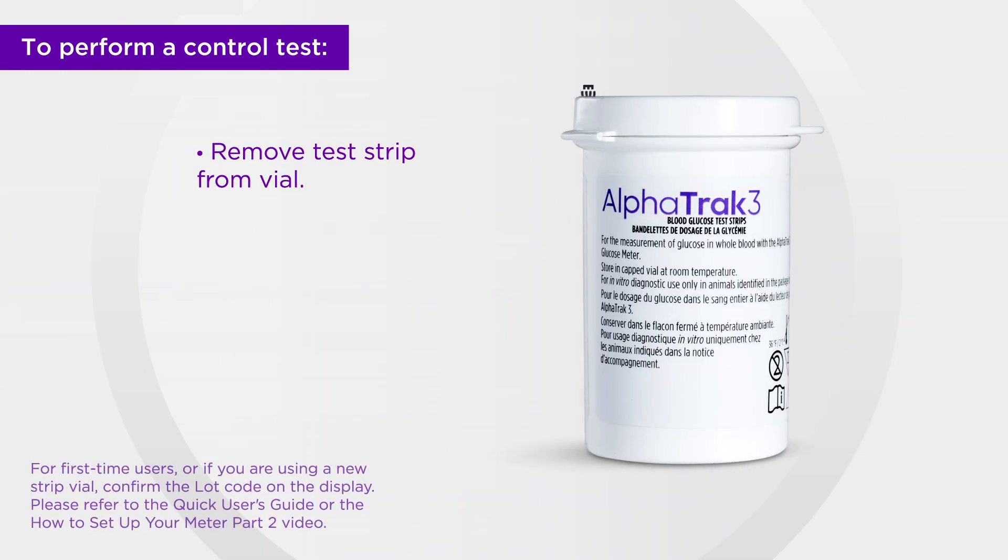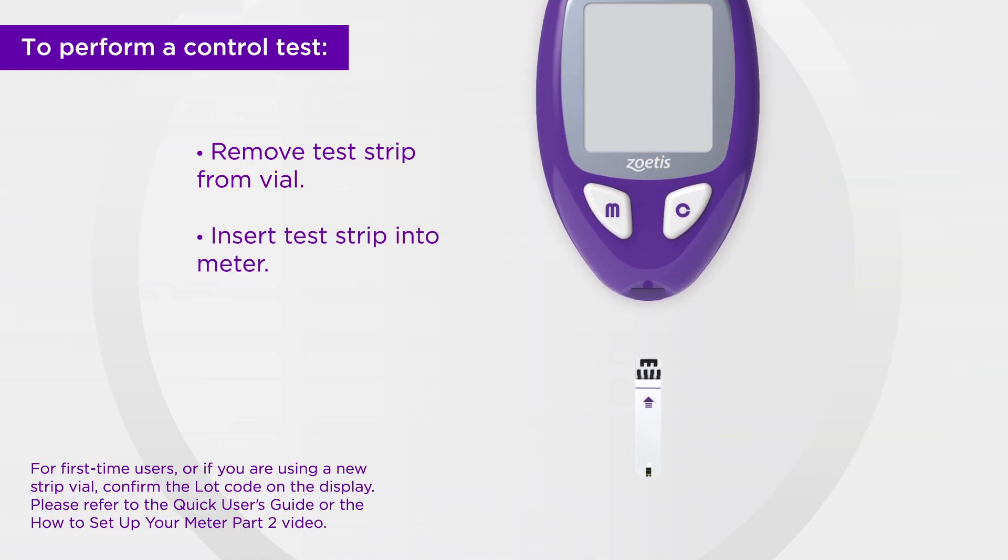Do not use a test strip if it has expired. To begin, insert the test strip into the meter to turn it on.